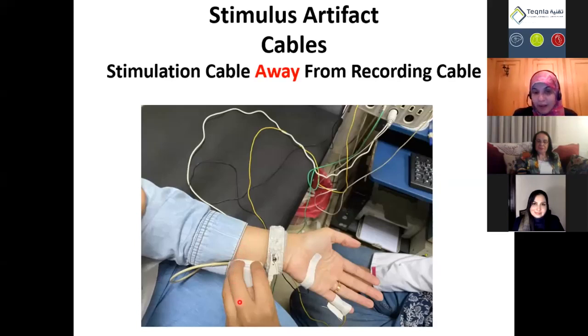And there is a recommended video I will put in the last slides that I recommend you to see. It's just about how the dipoles change. And Dr. Eric also said that rotating the anode affects the amplitude, and it was a nice point. So don't rotate it too much, otherwise you will have a smaller amplitude.